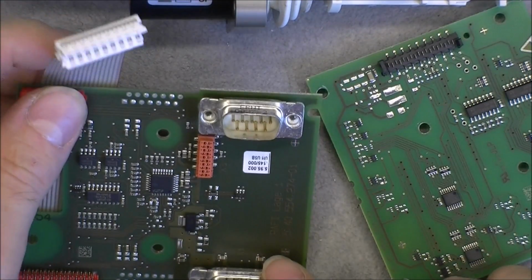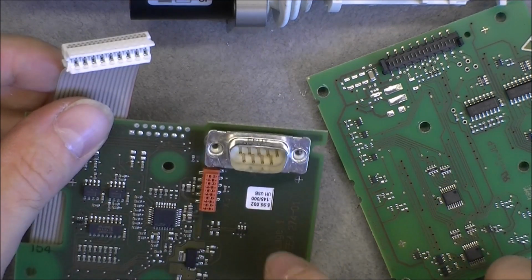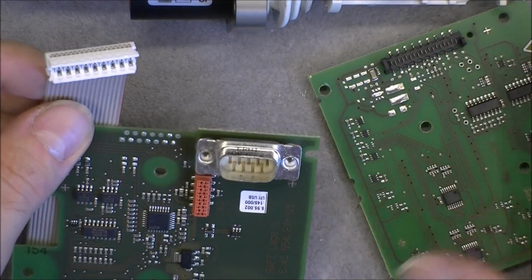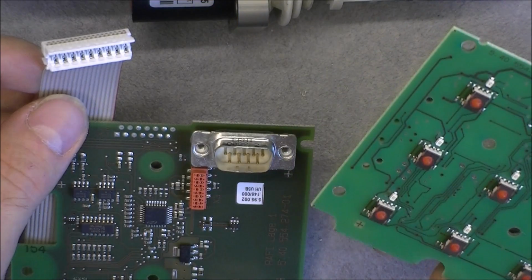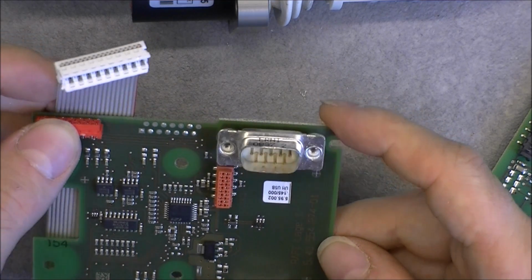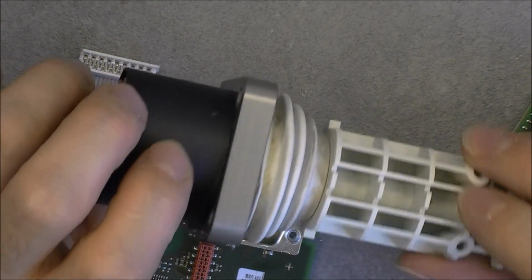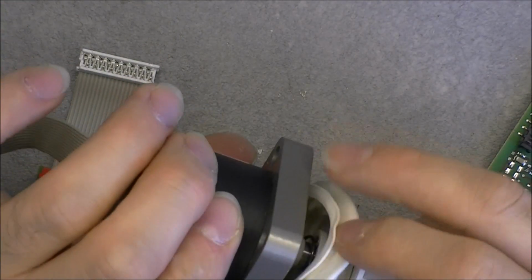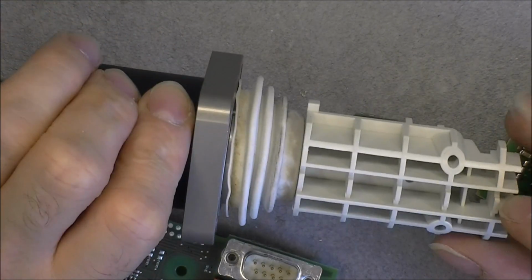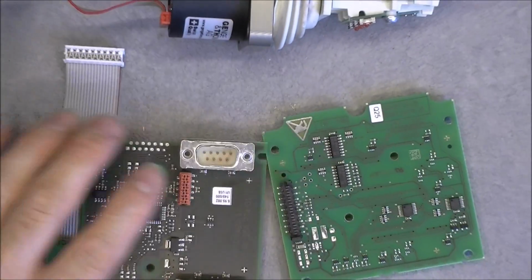You can expect in another video to see me trying to hack this thing, maybe at least find the pinout and try to apply power to it in order to see if we have lights coming on the PCB. Would be quite fun, and if I can actually use it, would be interesting, and probably some extra value if I want to resell one with an adapter cable to plug it to the PC. Could be quite nice. Okay, so this was the first of the controllers.